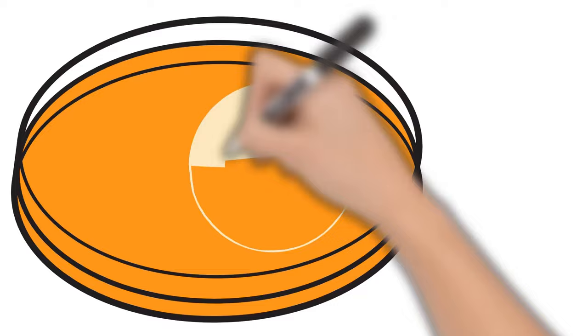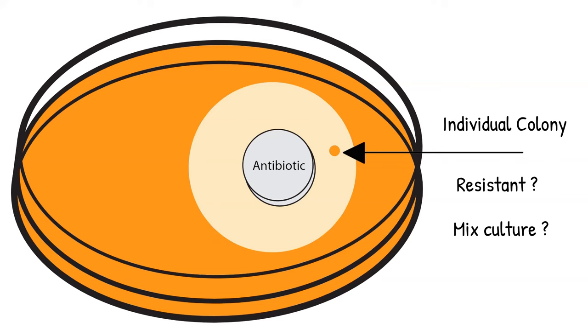If you see individual colonies in the inhibition zone, do not ignore that. The individual colony could be from your culture. You may have other organisms mixed in with your sample, or you may have some that is resistant to that antibiotic.